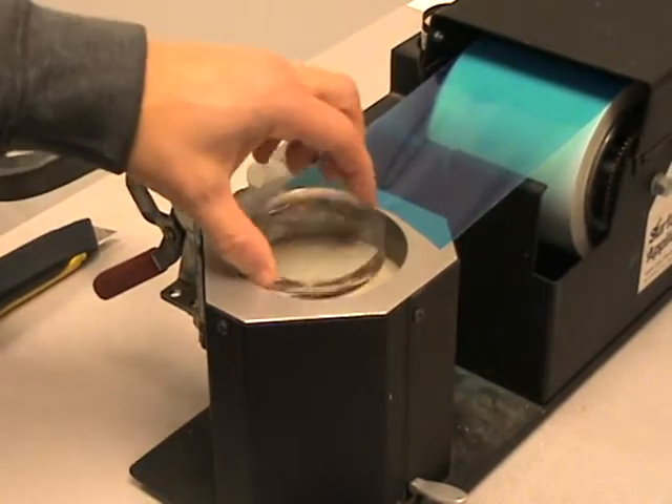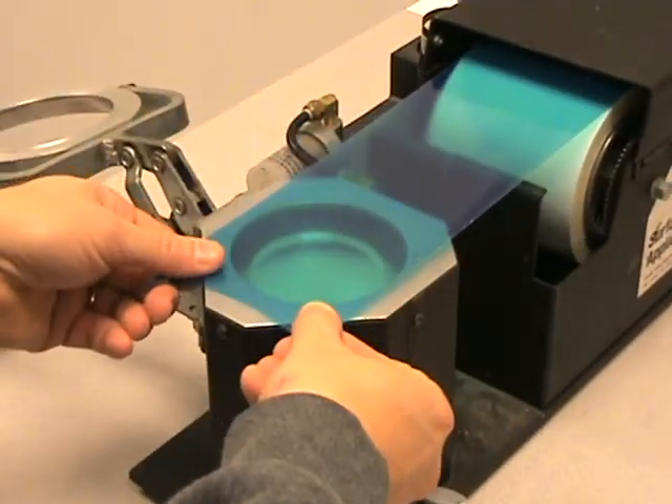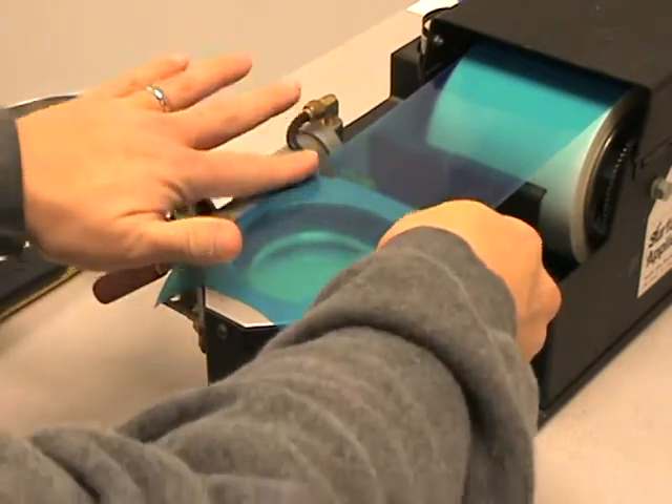The first thing we're going to do is place the lens into the center of the lens cavity. Then we're going to pull the tape forward. We will lightly touch around the very edges to create a good seal.